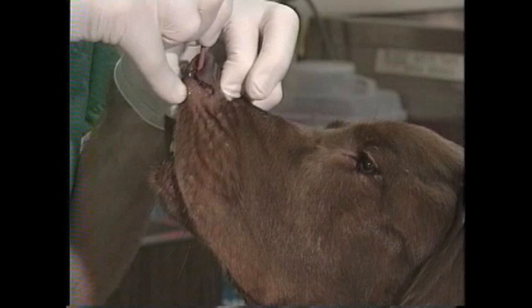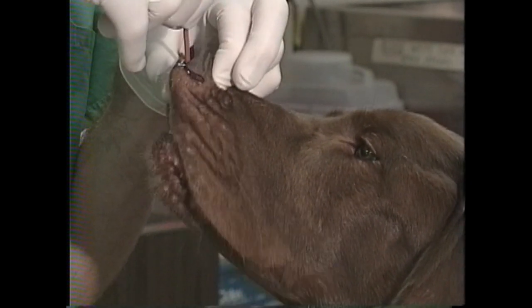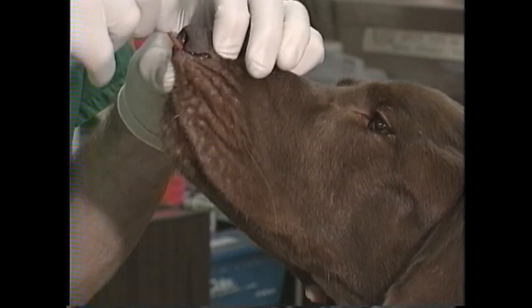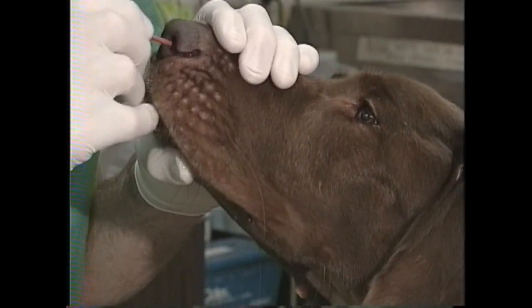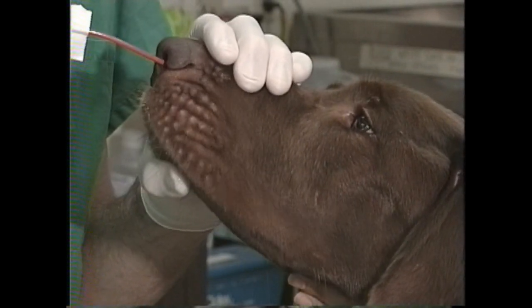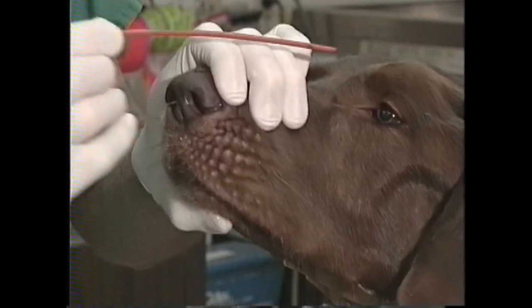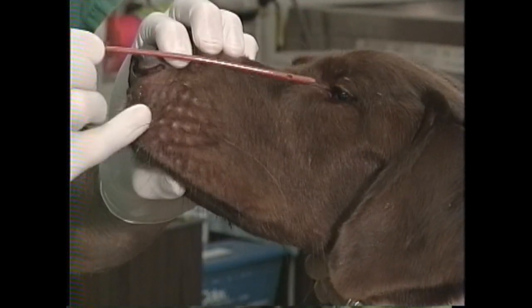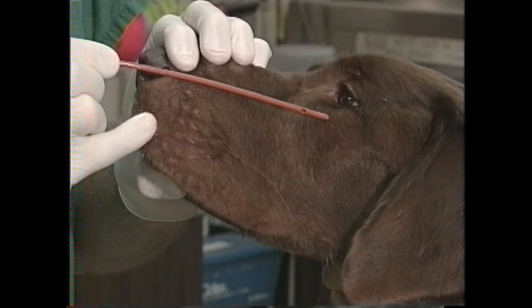That little oops showed up because despite this effort I screw up and the catheter rides over the middle turbinate and advances to the level of the ethmoid where it hangs up. I advance it with no resistance at this level, but once it reaches the ethmoid I experience firm resistance, so I'm going to bail on this attempt, remove it, and try again. When I pull it out and hold it up next to the dog's head you can see it advances to about the medial canthus of the eye — roughly the level of the ethmoid turbinate.